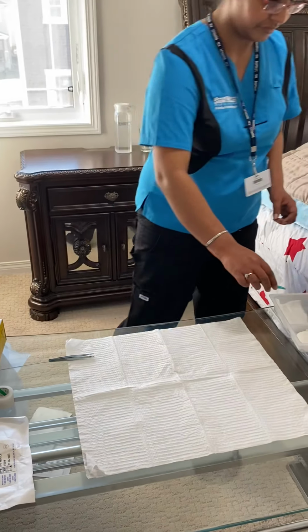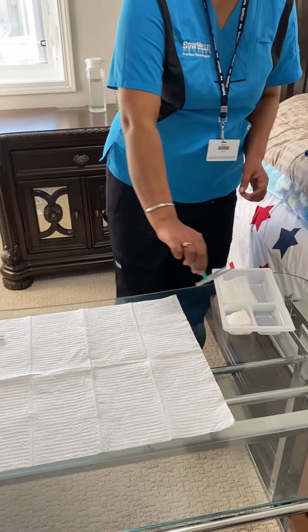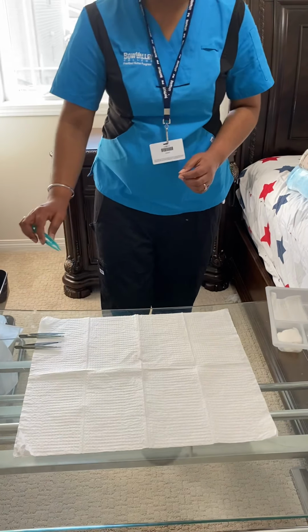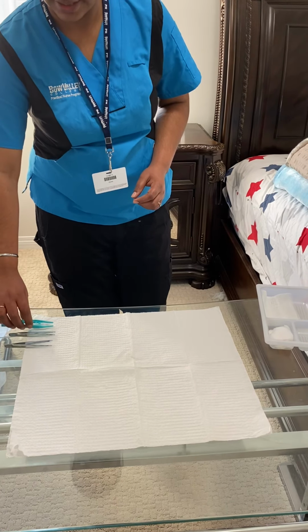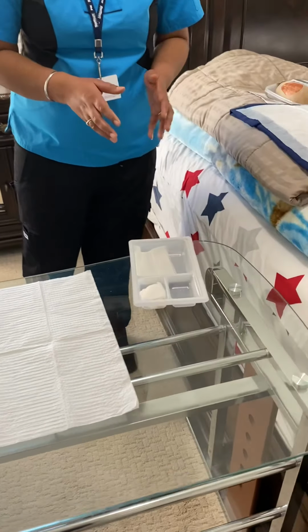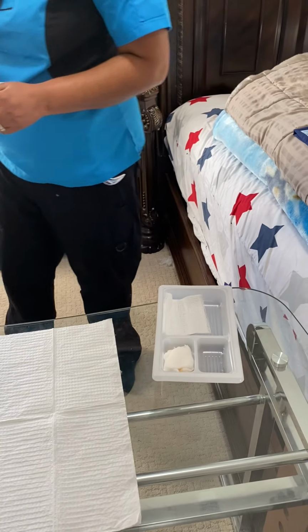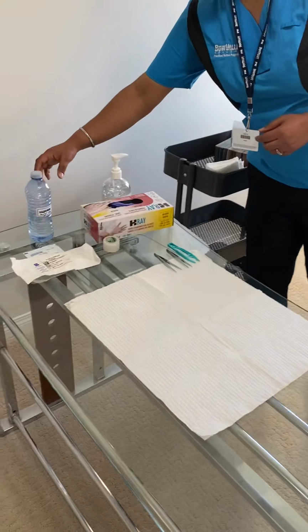centimeters, and the second forceps going backward without crossing the field, put it on the side, and my green forceps, I put it on the side. So here, and I leave my 4x4 gauze on the tray, and now I'm going to clean the wound. Before cleaning the wound, I'm putting the normal saline without crossing my field.